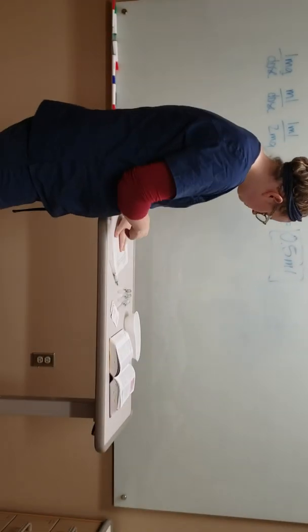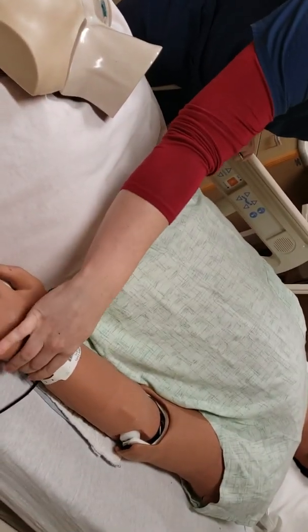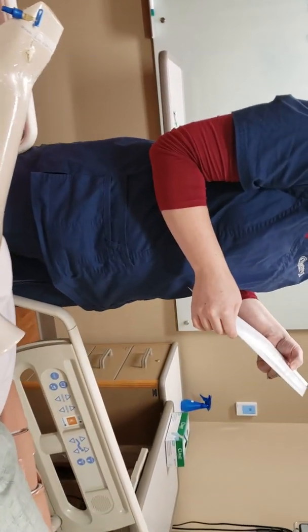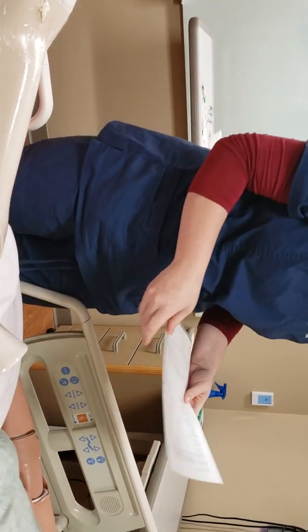And so, first I'm going to verify that I have the right patient. My patient's name would read as follows. It would be Mary Smith, born 5/18/1963. My patient does verify that.